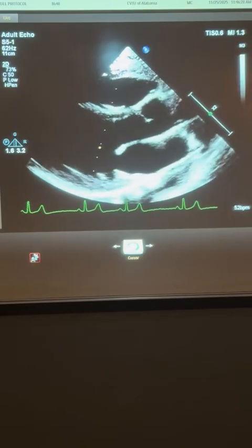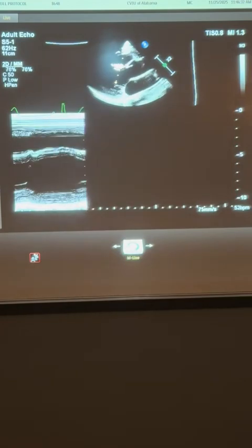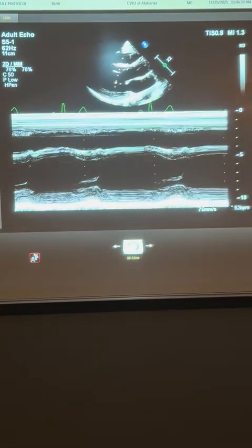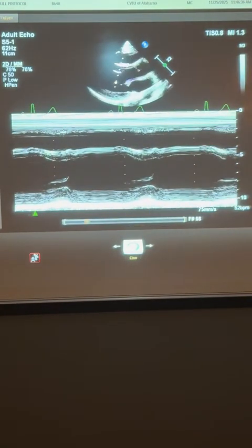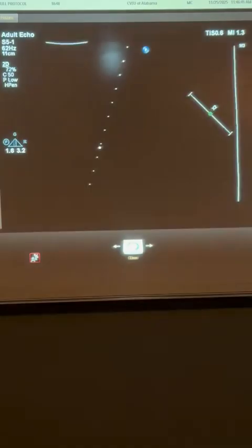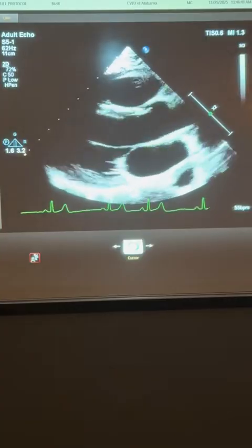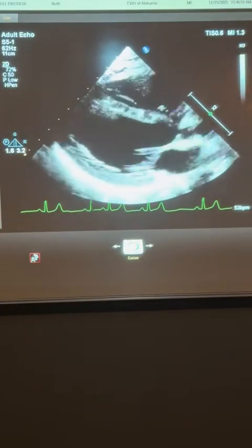And then we're going to come out and do our right and left ventricle M mode. Now for this one, we're not going to measure on it, but we want it as clear as possible in case we did want to measure on it. So we're going to take that image. So now I'm going to get my parasternal nice and opened.